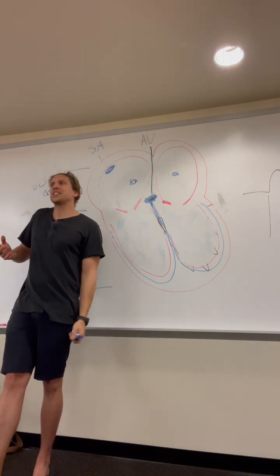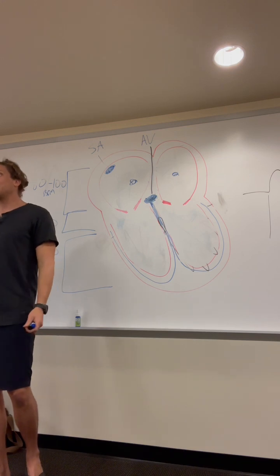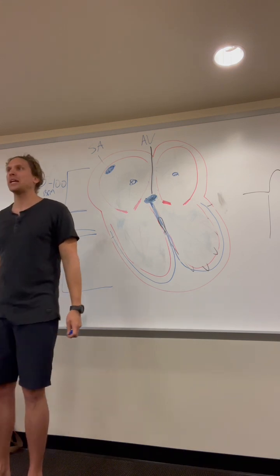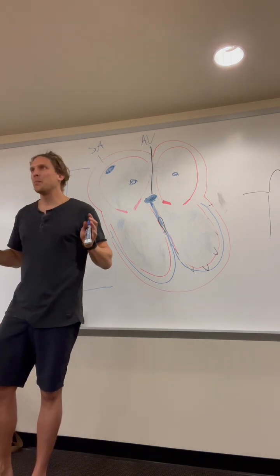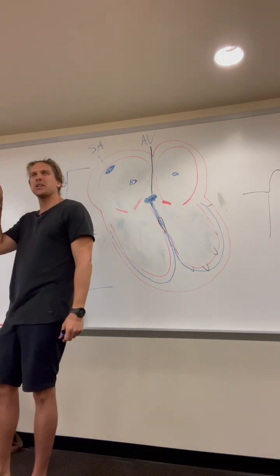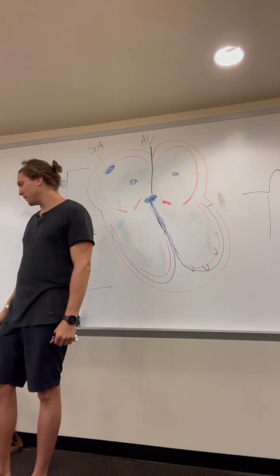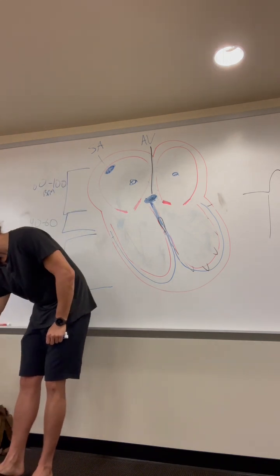Now, on the test, I could see there being this heart rhythm, but they don't have a pulse. That's PEA. It looks like a normal heartbeat, but there's not an actual pulse happening. It could show up as a big QRS, but it's just a little bit of electricity going through the heart, not doing anything. So that's why I put PEA on the bottom there.